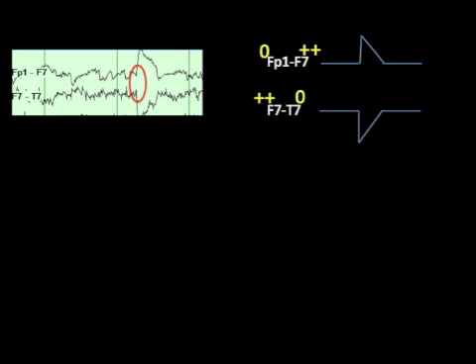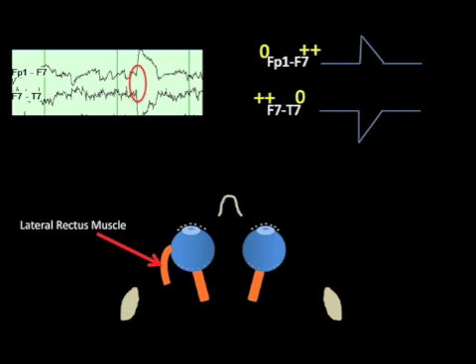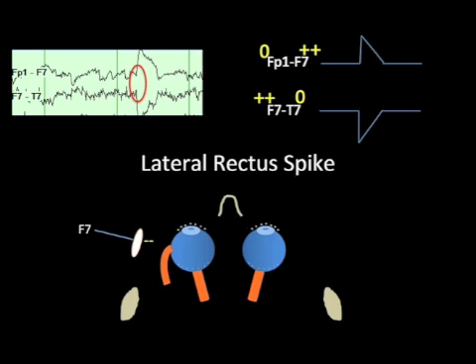There is one last detail on this particular tracing. You can see that there's a very small spiky waveform just before the eye movement. When we look at our diagram again, we remember that in order for the eyes to move to the left, the lateral rectus muscle has to contract. The lateral rectus muscle is very close to the F7 electrode, and so the initial activity before the eye movement is a small negative charge secondary to the contraction of the lateral rectus. This is known as a lateral rectus spike, and this artifact is sometimes mistaken for an epileptiform discharge.